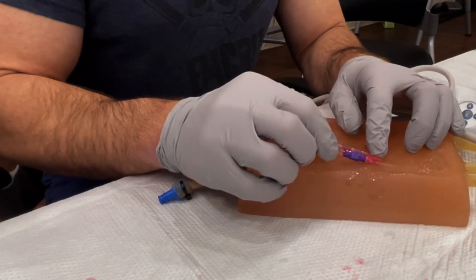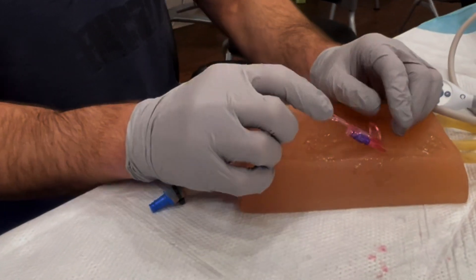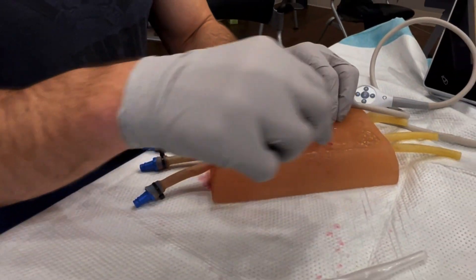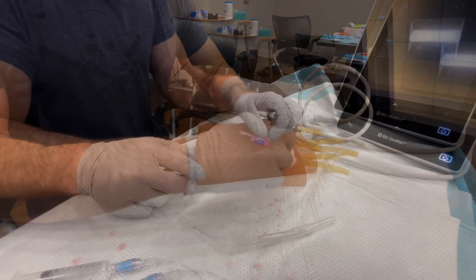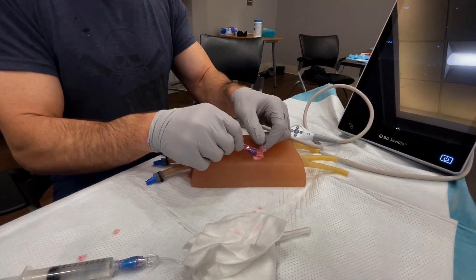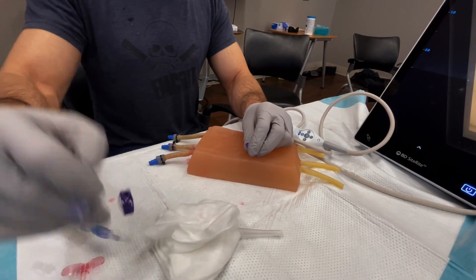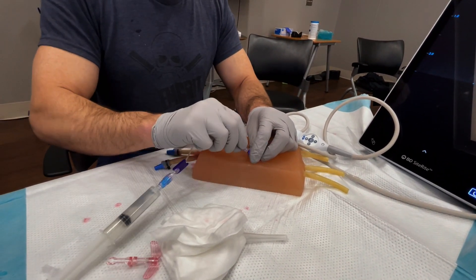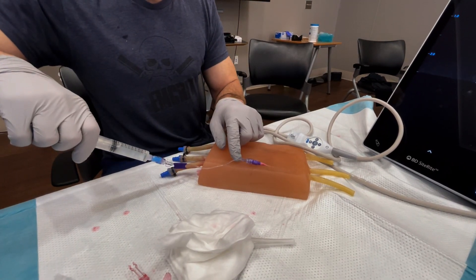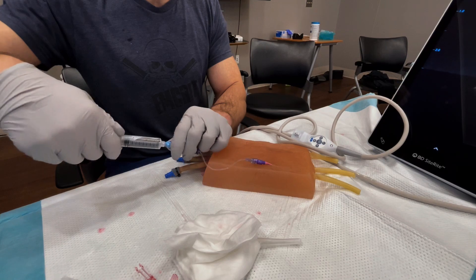There's a little stopper on here now, so you won't back-bleed at this moment. This gives you an opportunity to clean the patient with gauze and wipe off all the ultrasound gel. At this point, lift it up and pop it off — now you'll start the back-bleed. If you have your J-loop ready, it's already pre-flushed, so you can just connect it. Pull blood back to make sure you're getting blood return, and then flush the catheter.